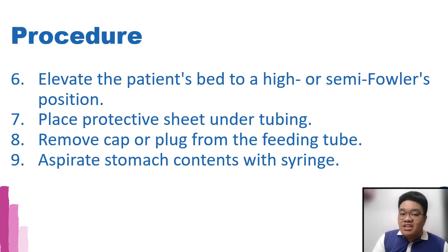Sir, will I still return if more than 100? Yes, class, you still return to your patient because that gastric content contains a lot of acid and it also contains a lot of potassium. So we don't want that to be out of your patient's body.